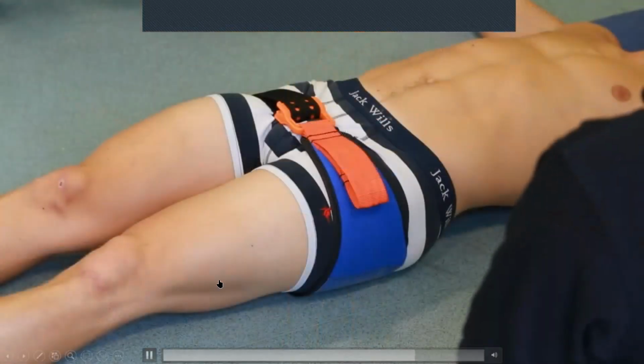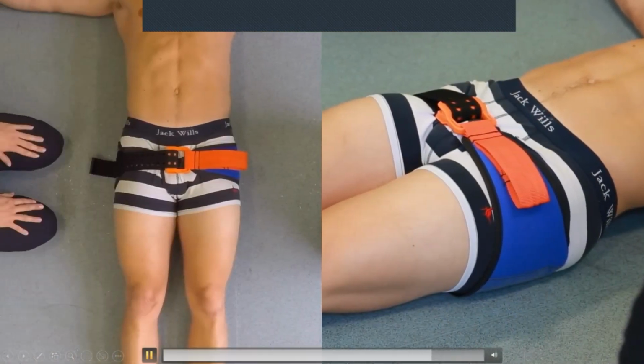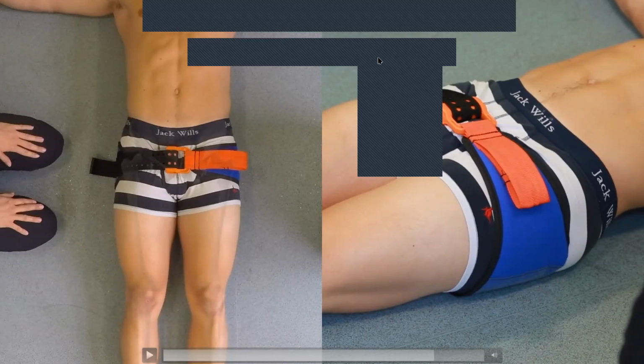All right. Now, it's extremely important to get this right. So what happens is you've got a nice thin man here. You can see he's got abs and he's relatively quite small. Now, what happens if you get somebody who's bulging like that and you can't actually feel the greater trochanter correctly? It is very difficult, that's for sure. So what you can do is use any other anatomical marking. I'm just going to illustrate it here. Let's do it in blue and pink.